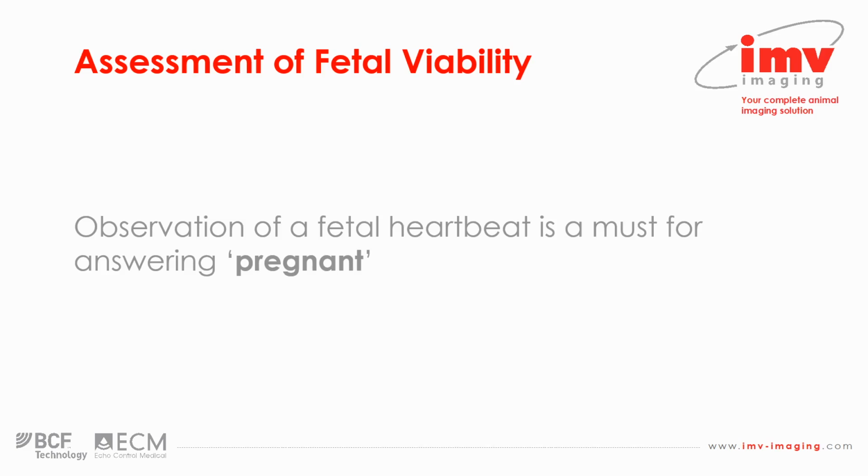Not everybody necessarily agrees with this statement, but I think generally speaking it would be fair to say that observation of a fetal heartbeat is a must when you say to a farmer that you're going to diagnose that animal as being pregnant.